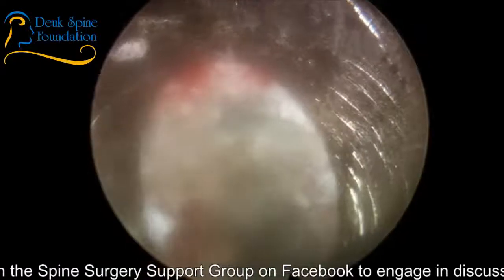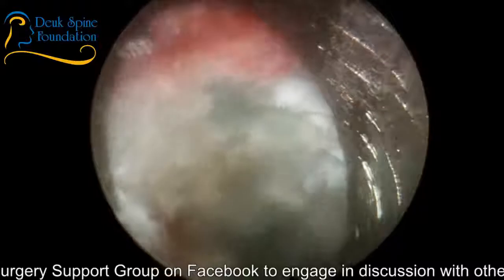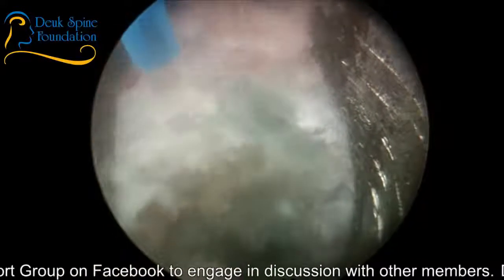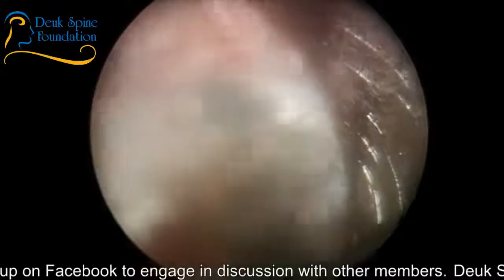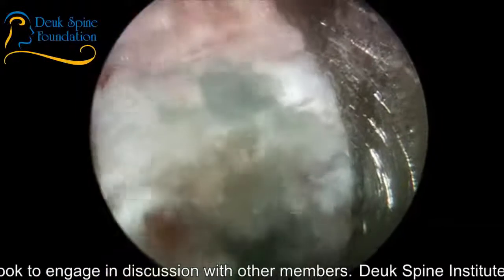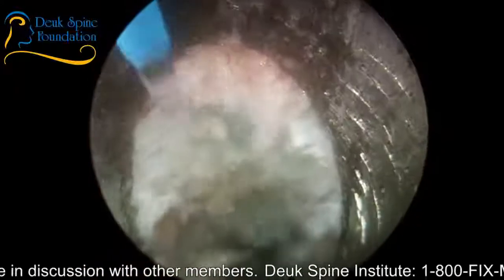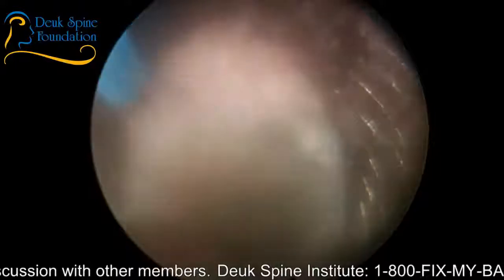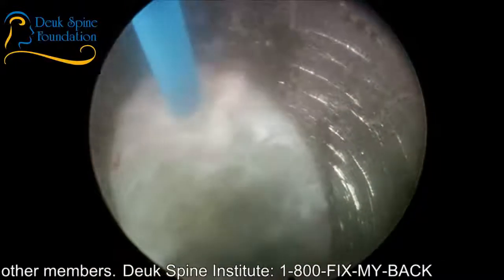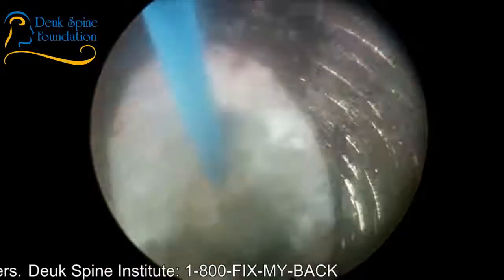So we're going to need to come back a little more and again use the laser to free things up. Get that suction off, please. I don't want the suction. Where is that coming from? East right there. Okay. I was going to say, I don't see it there at the bag, or I don't see it at the adapter.